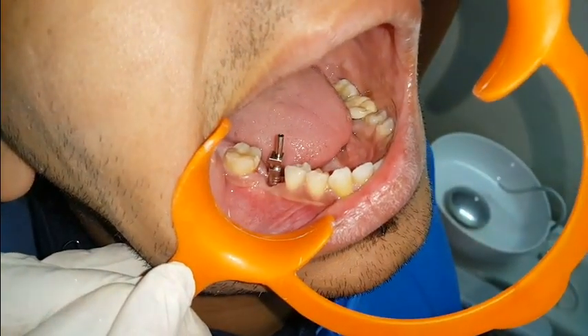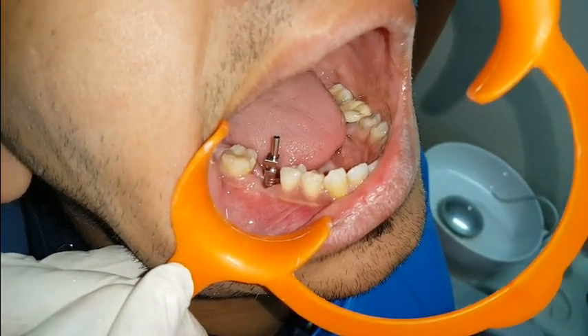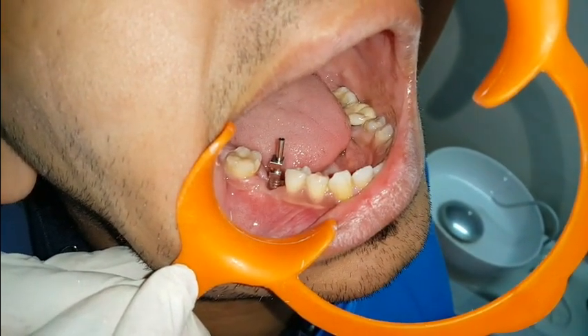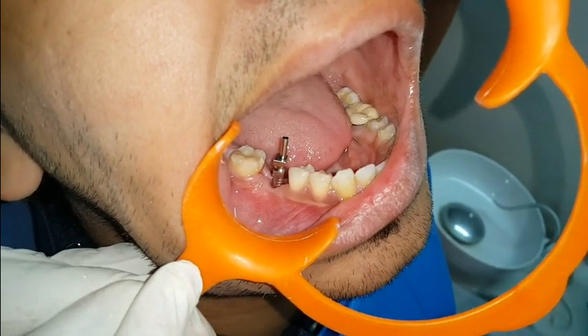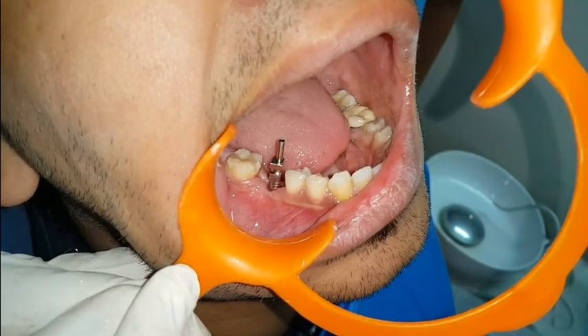Now this pickup type impression coping is attached with the implant fixture and we will take one X-ray to confirm that the impression coping is fitted accurately without any spacing at the implant.